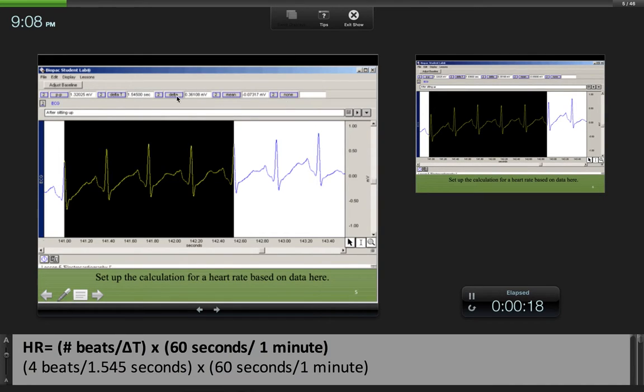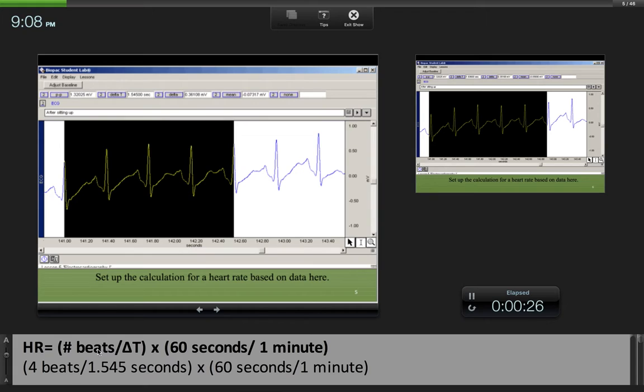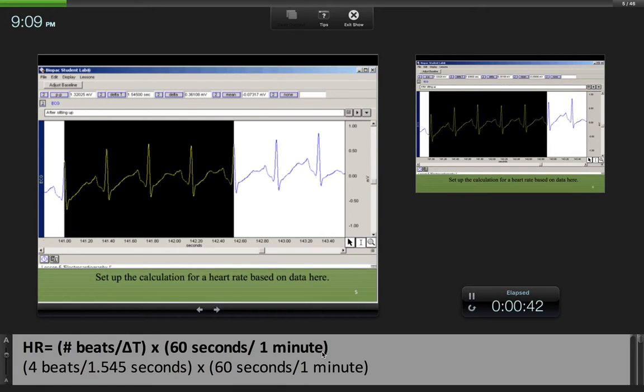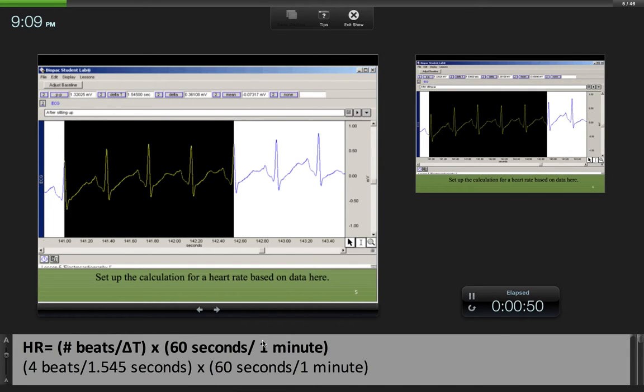We're going to have a series of heart rate equations that we need to set up. We need to know two things: the number of beats that are highlighted or dark-lit, and the amount of time that it takes for that to happen. We're going to set the number of beats in the numerator and the change in time in the denominator. We're going to multiply that value by 60 seconds over one minute, and it'll cancel out our seconds in the delta T, which will leave us with beats per minute.